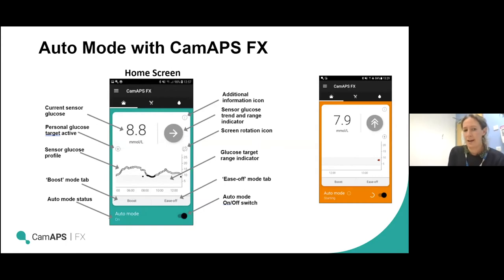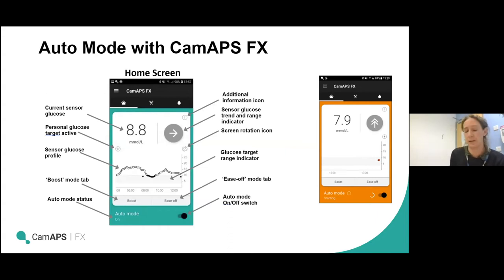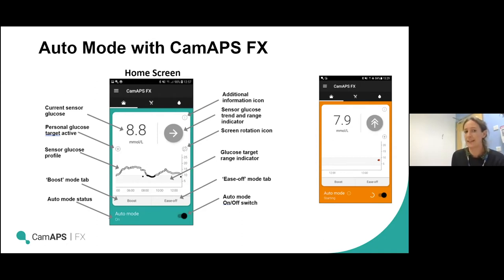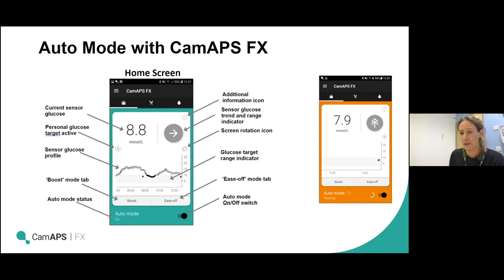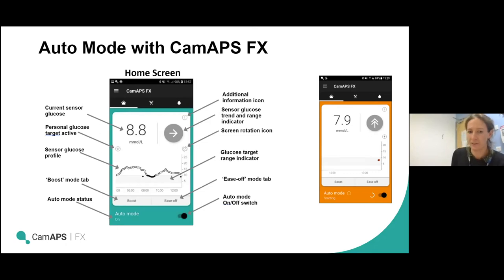When you enter the CAM APS FX app, bear in mind the phone needs a pin code — that's important if you're expected to keep an eye on the glucose or potentially bolus. On the home screen, the biggest and most important thing is the glucose level, shown with an arrow indicating the trend. Here it shows 8.8 with a flat trend arrow. There are different arrows: a double arrow going up means glucose is steeply rising; a double arrow going down means it's steeply falling; and there are arrows in between for gradual changes.